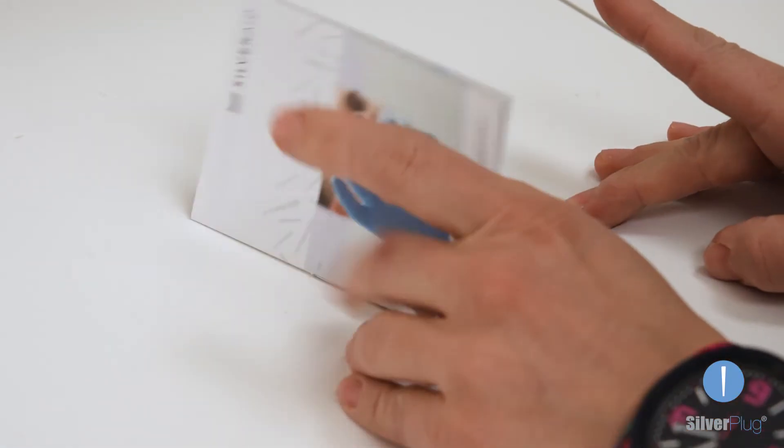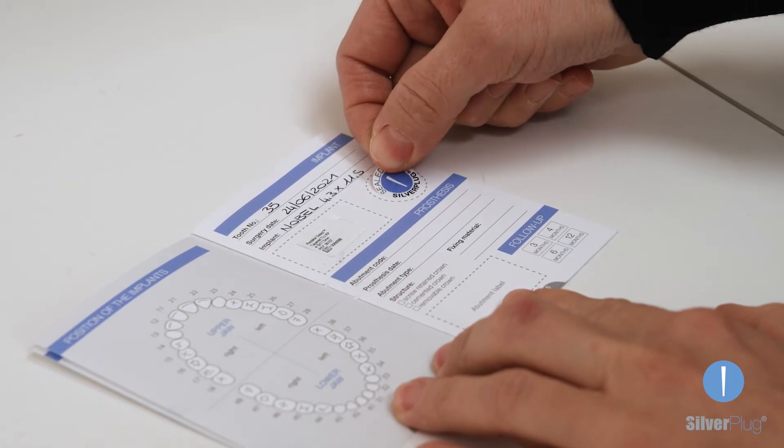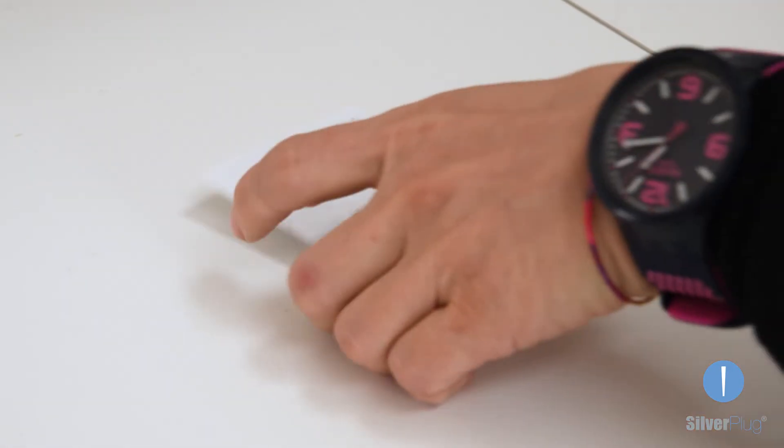Remember to certify the use of Silverplug by affixing the dedicated sticker on the implant passport to be handed out to the patient.